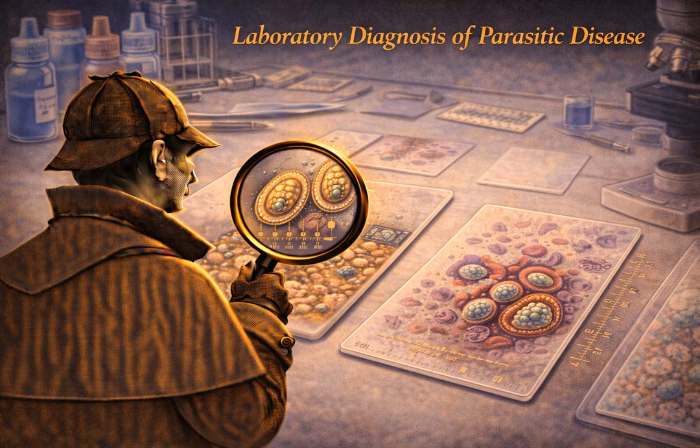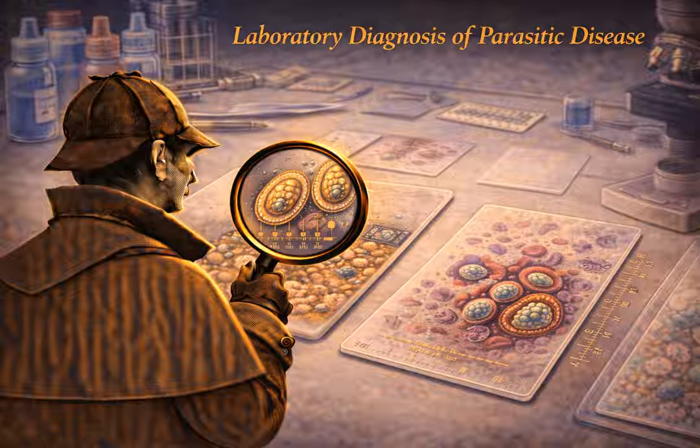So a liquid stool specimen is essentially a stat lab order. It has to be treated as one. It must be physically examined under the microscope within 30 minutes of collection, or it must be placed immediately into a chemical preservative like PVA, which is polyvinyl alcohol, or 10% formalin. If a nurse leaves a liquid stool cup sitting on the counter for 2 hours while they go on a lunch break, the evidence is entirely destroyed.